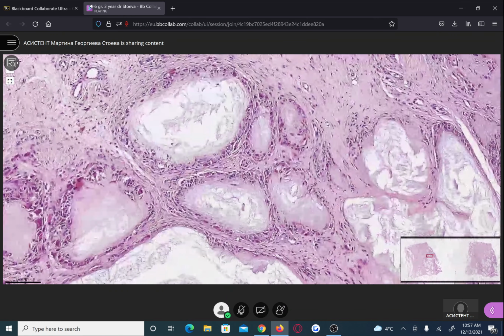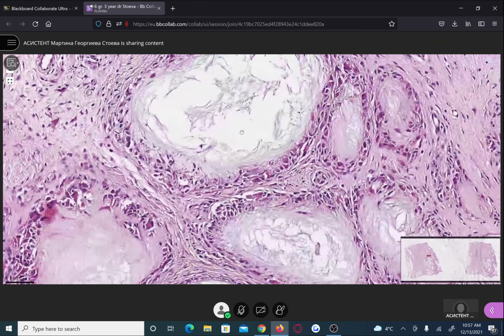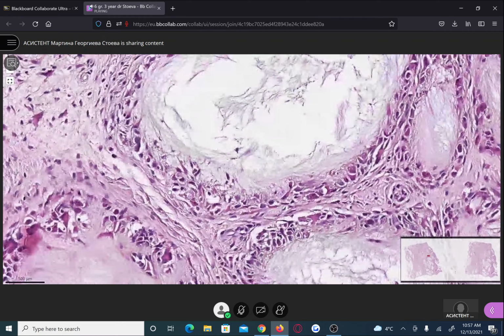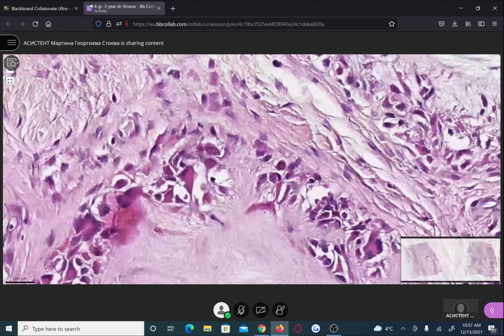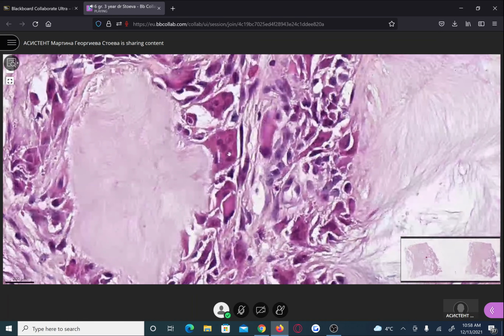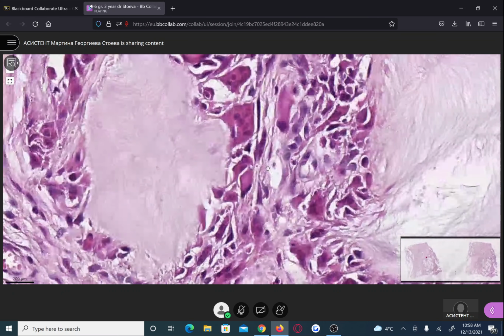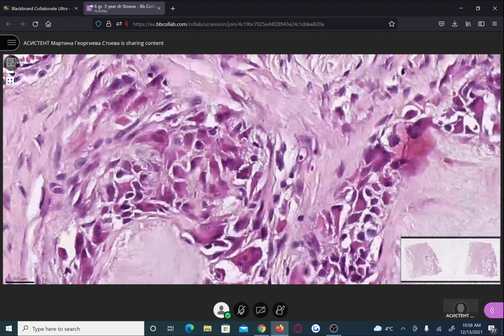The inflammatory cells that are visible surrounding the center of uric acid deposits are lymphocytes. You know that the lymphocytes look just like dots because we can see only their nuclei without cytoplasm. And the other cells that are formed are multinucleated giant cells. They are foreign body type, but not Langhans type, as is characteristic for tuberculosis and sarcoidosis as well.